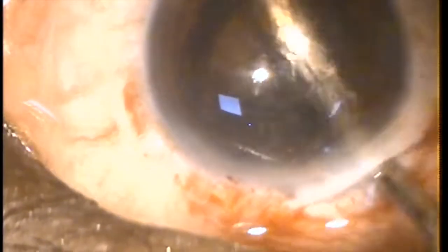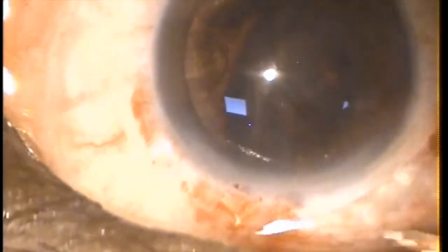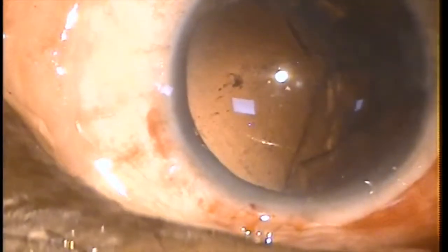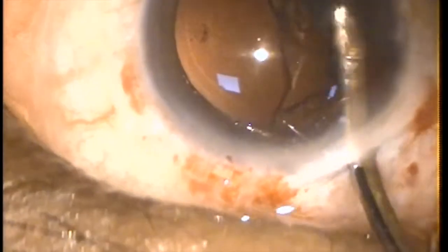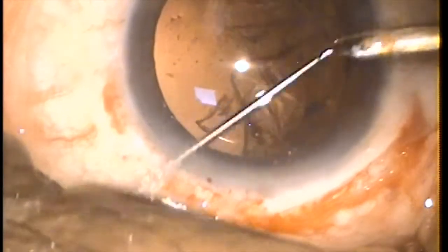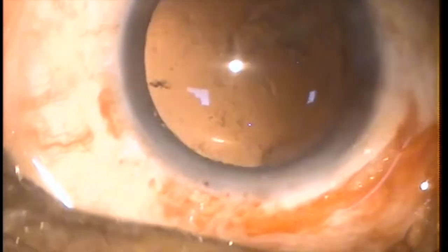The epinucleus and cortex can be aspirated, or just by pressing the posterior lip the cortex comes out. This is an easy, cosmetically good, atraumatic, and painless technique. The cortex is removed starting from the side port incision, from the edges of the capsular opening, and finally the sub-incisional cortex. This technique ensures no pain because the iris is not touched and the anterior chamber is not allowed to collapse at any point. The side port incision is of great help in this regard.